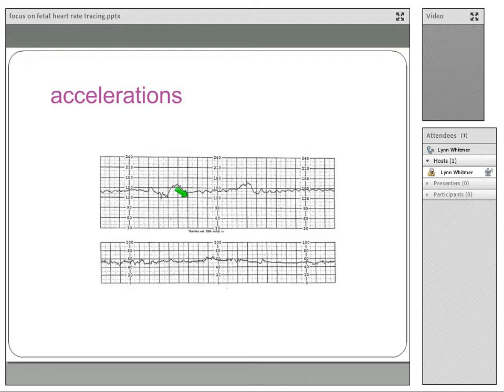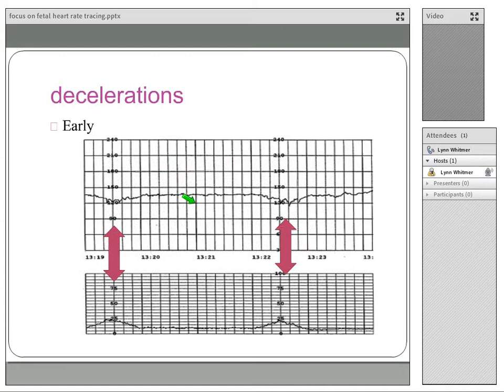And then this is his sleep cycle, where he's now tired and he's going to sleep because he's had two movements here and here. So accelerations are positive, and as I'm pointing those out to you. Decelerations, not always a good thing, but not always a terribly bad thing.